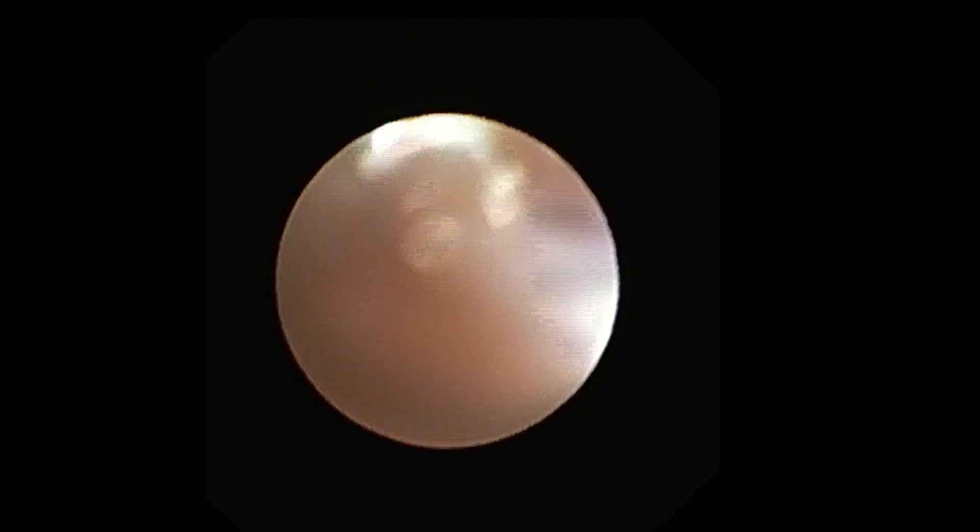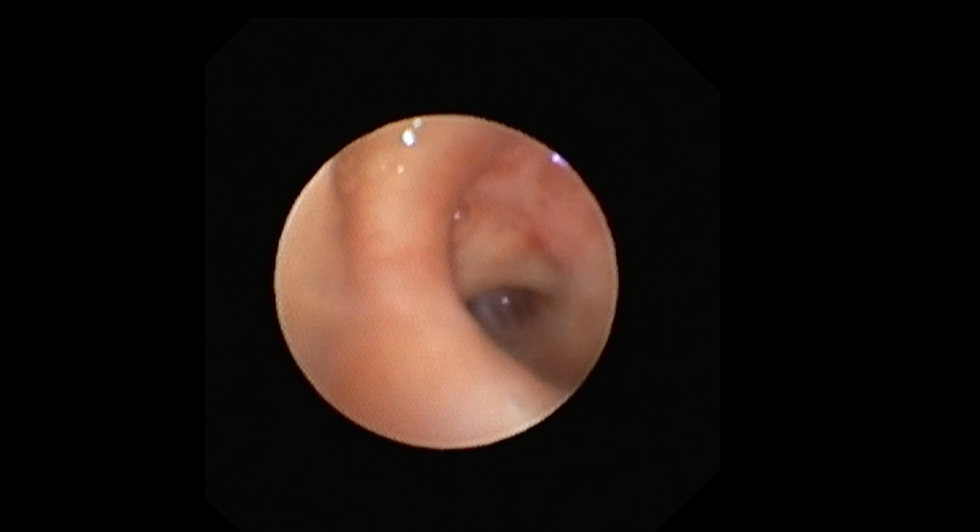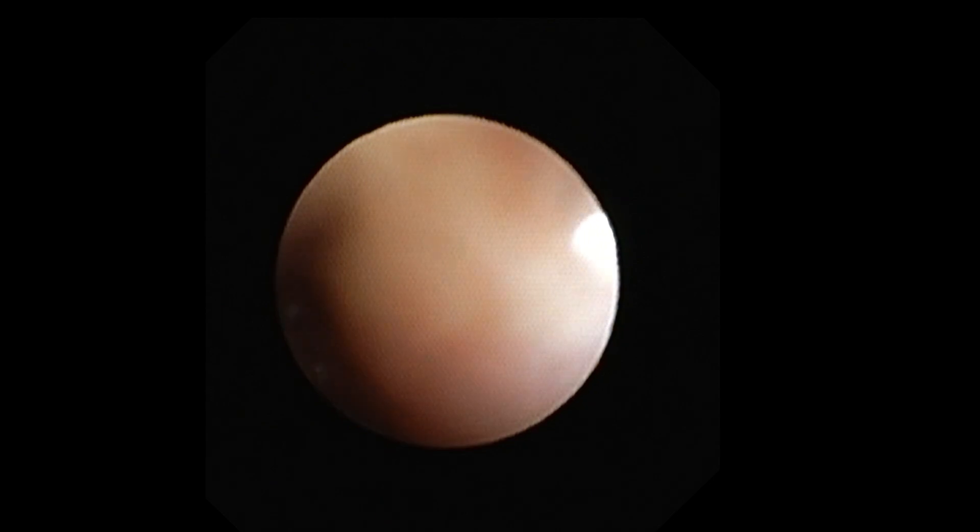Silver nitrate was applied to the fistula tract, a spigot was inserted into the medial basal segment, and cyanoacrylate glue was applied. Glue was also applied from the esophageal end of the fistula.